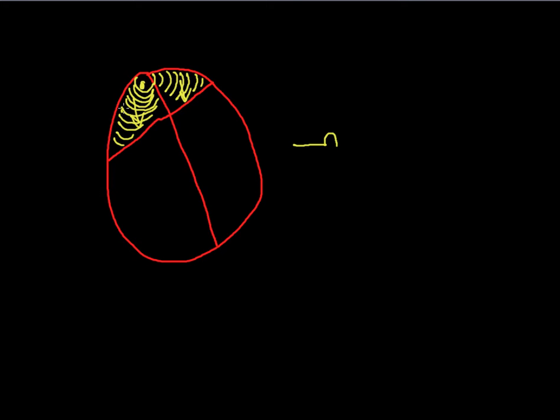Well, this at this point is the atrial depolarization. And Wilhelm Einthoven, when he went through this, had tried to determine what the heck is actually going on here. He was able to see that it was the atria that were depolarizing. I'm going to go over this in your lecture, so you'll have a bit of an overview, but I wanted you to have a video version of this to kind of refer to because I'm going to go through fairly quick in class. So, if I come back over here, this is the atrial depolarization.